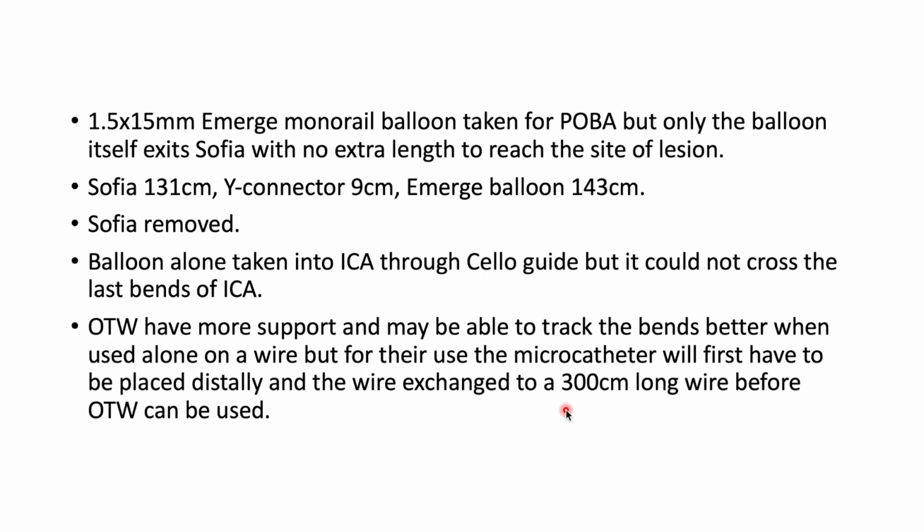Because the Sophia itself is 131 centimeters long. The Y connector is another 9 centimeters added to it, so it's around 140 centimeters. And the Emerge balloon is 143 centimeters long, which means hardly 3 centimeters of the balloon itself comes out. The remaining shaft is inside the Sophia. So then I decided to remove Sophia so that I could gain length and take the balloon up.